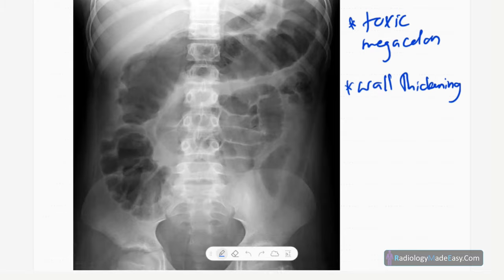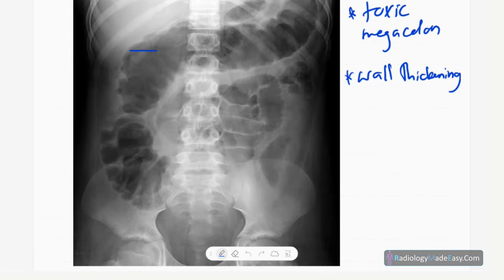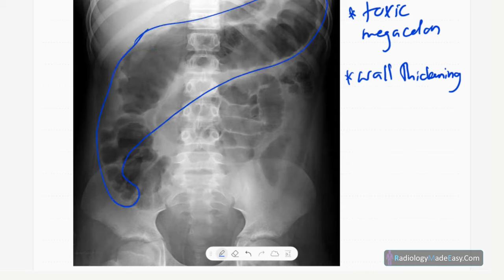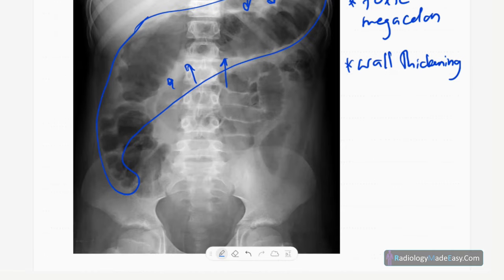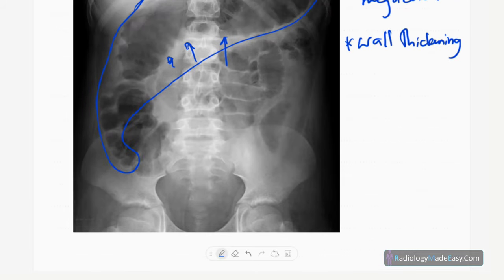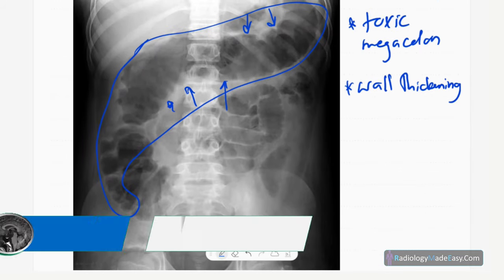Now let's look at the imaging features, starting with X-rays. This is a frontal radiograph of the abdomen. You can see dilatation of the transverse colon and ascending colon, with thickening of the bowel wall due to colitis. This is toxic megacolon — a complication of ulcerative colitis with poor prognosis. However, there is no free air within the peritoneum.